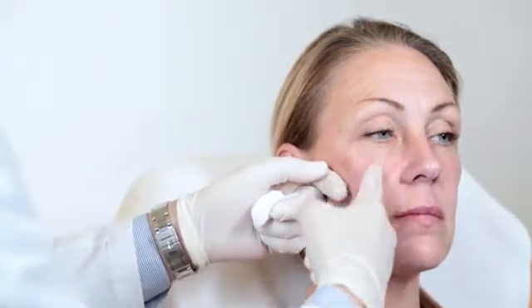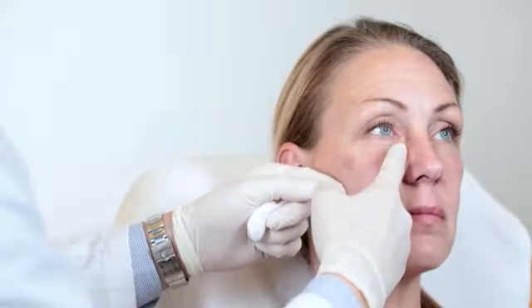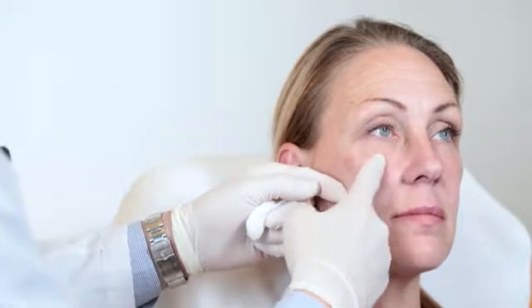I start by carefully disinfecting the entire face after having it washed and all the makeup removed. This is particularly important when working with microcannula as you cover a larger area. Now I choose to inject Ami's cheek with the cannula due to the vicinity of the facial artery. If you only aim at a lateral augmentation of the cheek, you might as well use a sharp needle for that.